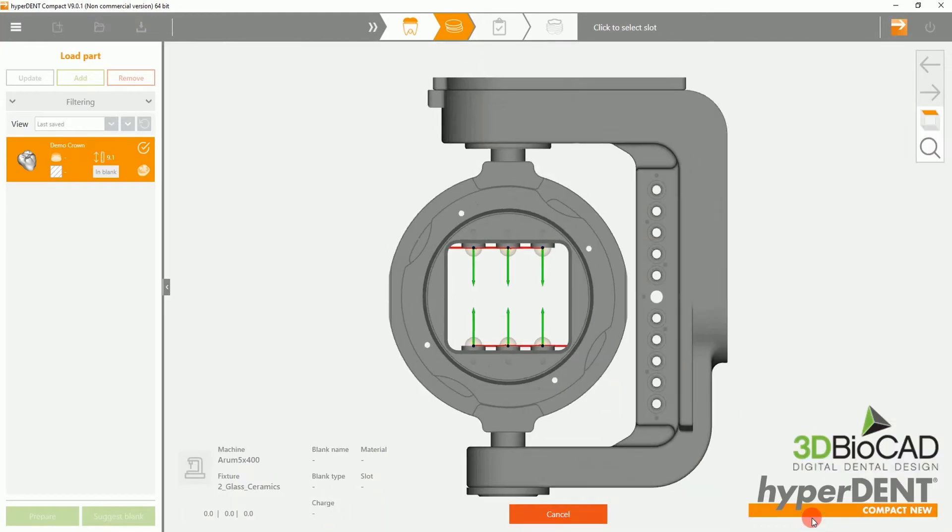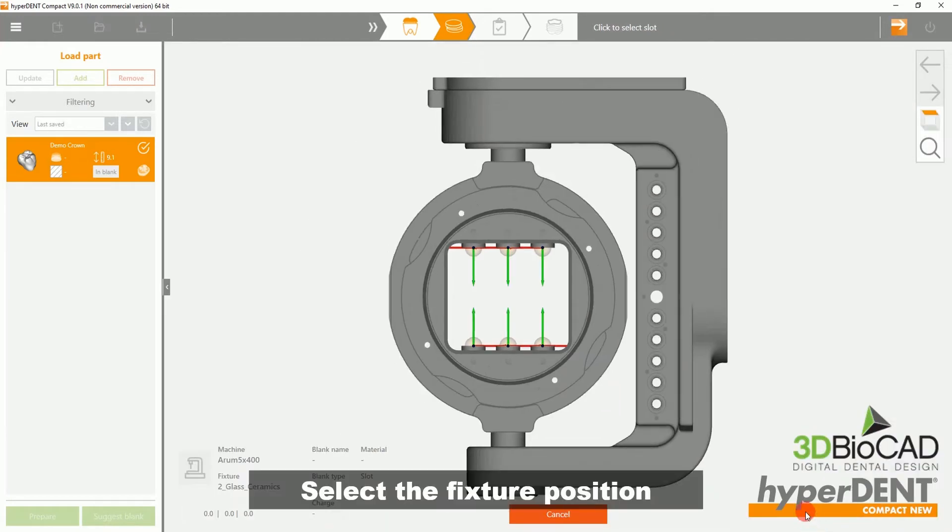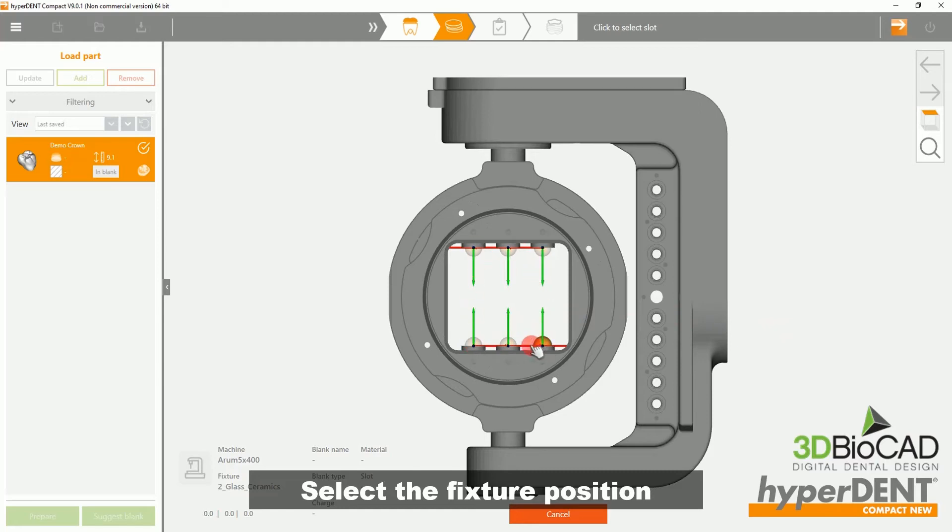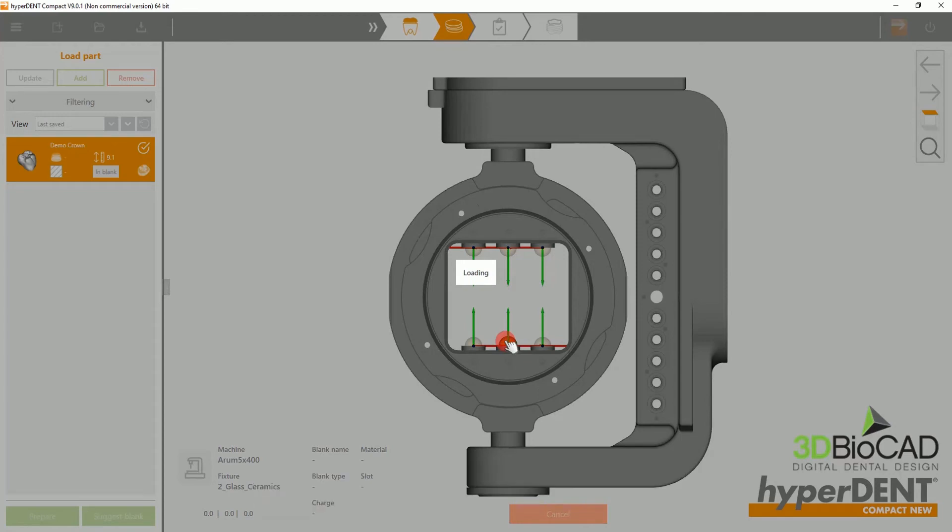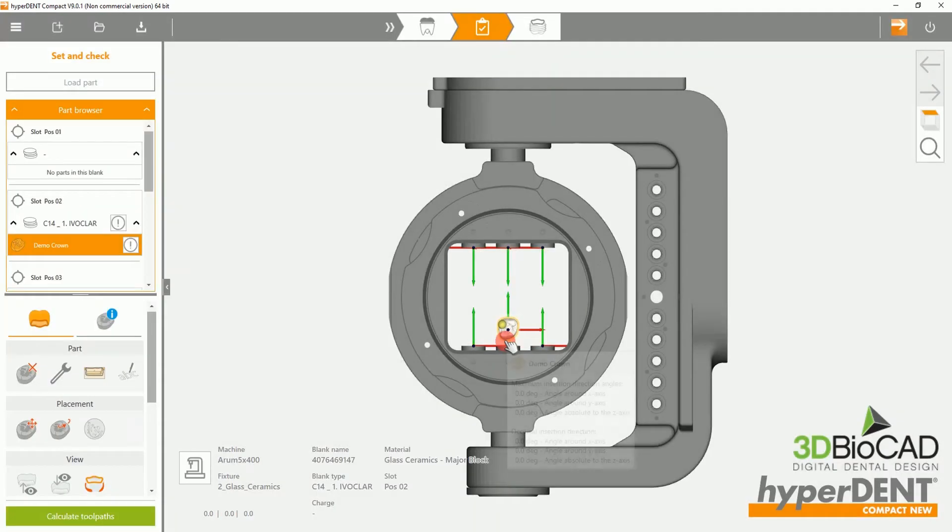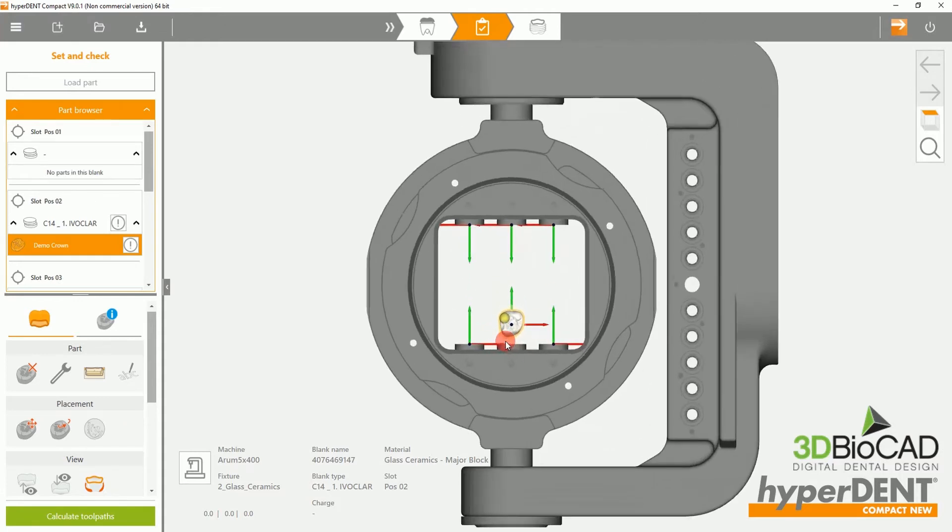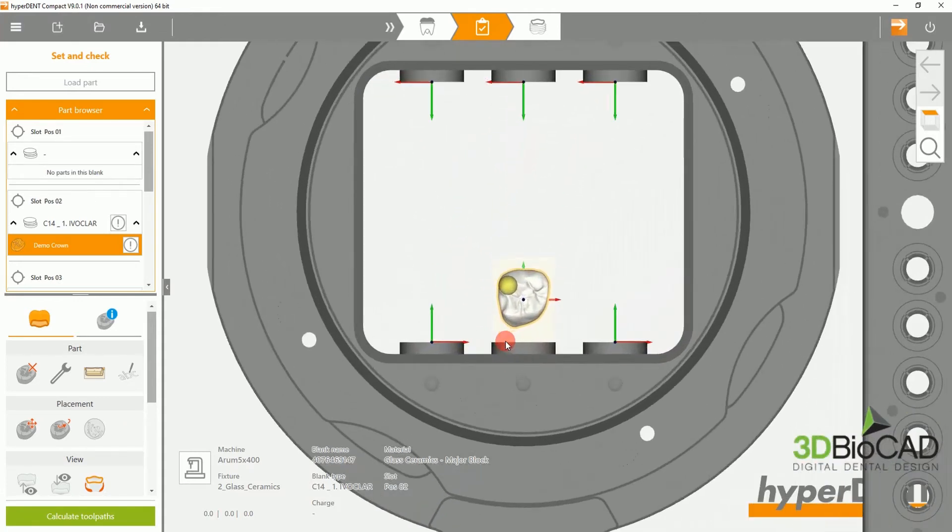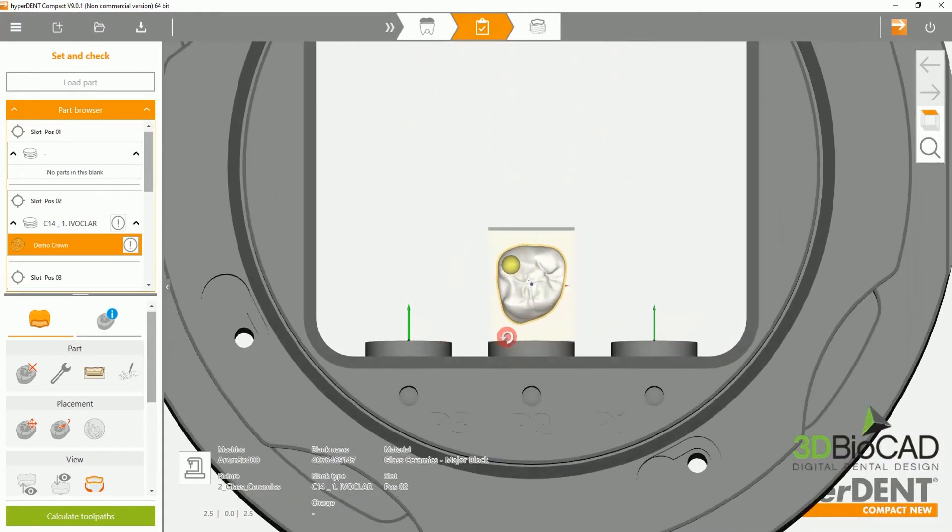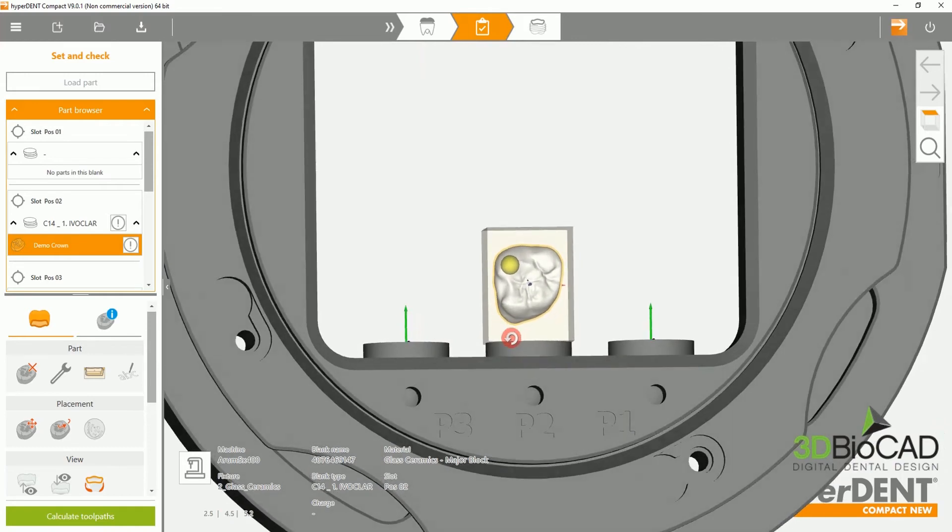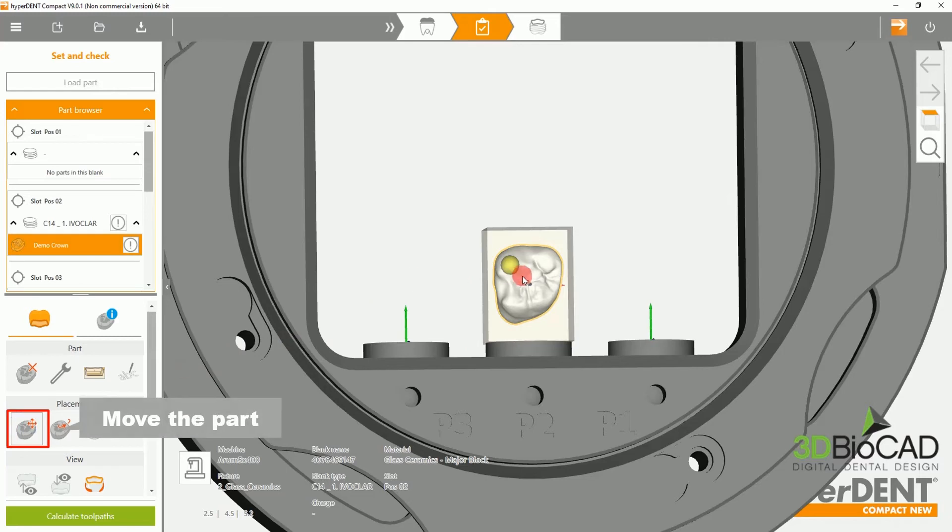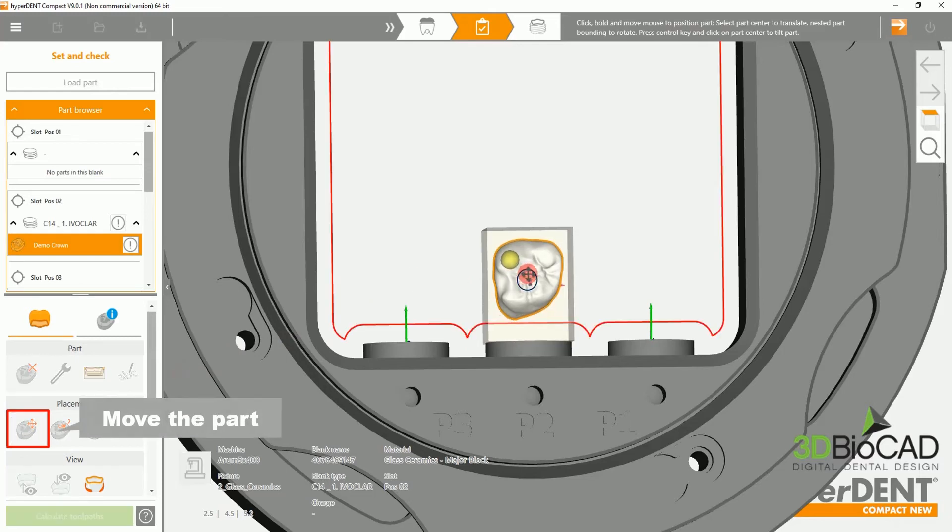On this page, we will be selecting the fixture position. Click on one, it will add the block into the fixture. Please select the move part and move the crown to avoid any contact with the red line inside the fixture.